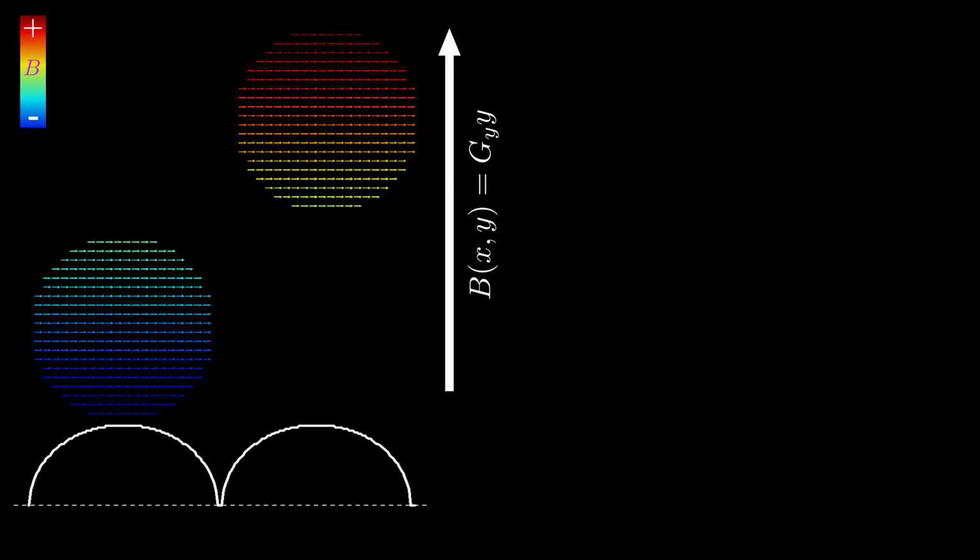You might think it's as easy as doing the same thing but with a y gradient, but this would only give us another 1D projection just in the y direction, not the 2D map of spins we want. And any combination of x and y gradient strength simply yields a different projection angle through the sample, but we still only have a 1D projection. But wait, you say. What if I did this?